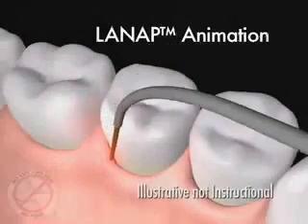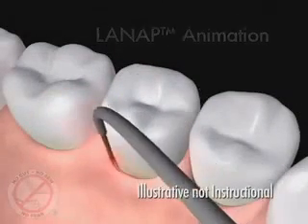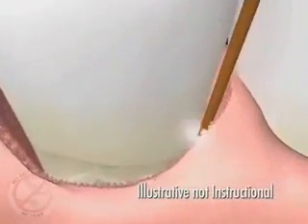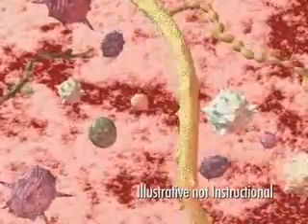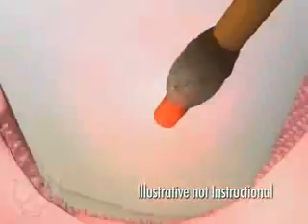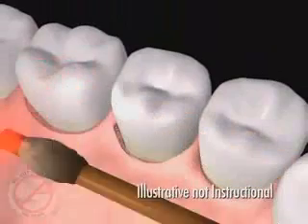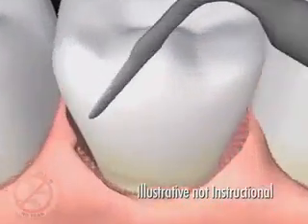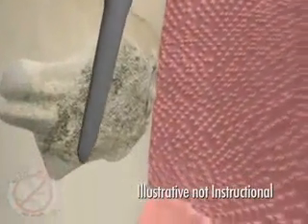The Periolase fiber, about the size of three human hairs, is gently placed between the gum and teeth to remove the diseased tissue inside the pocket. This laser fiber selectively removes the diseased tissue and kills the germs that cause gum infections, while leaving healthy tissue unharmed. This also improves access and visibility for better removal of the barnacles of calculus from the surface of the teeth. Tiny ultrasonic root cleaners vibrate these deposits away and flush them out with antibacterial rinse.